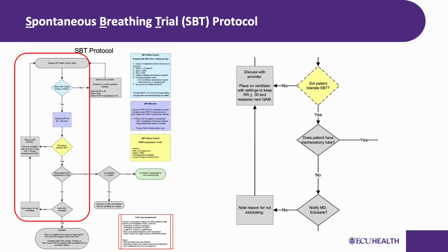Continuing with the SBT protocol, let us look at what happens after a patient completes the SBT. This part of the algorithm addresses the next clinical decisions you need to make based on the trial outcome. If the patient has passed the SBT, meaning they tolerated the 30 to 120 minutes of minimal support without meeting any of the failure criteria we just discussed, the next step is to assess for extubation readiness. Passing the SBT is a major milestone, but it is not the only factor.